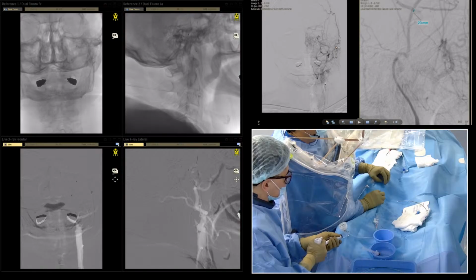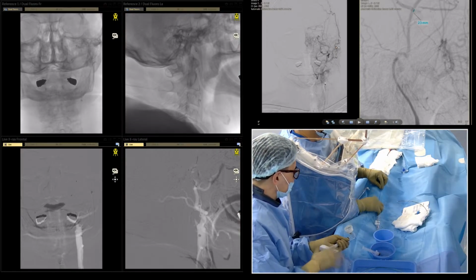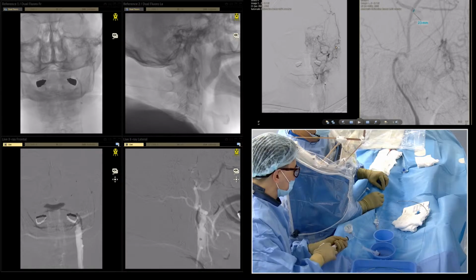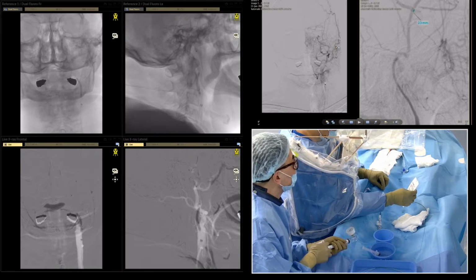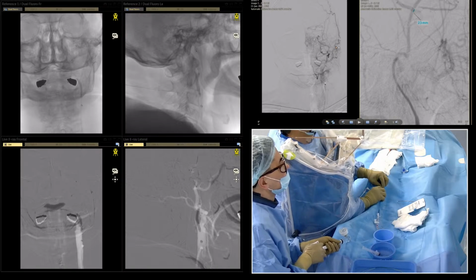So, earlier. I pulled my guiding a little bit. Earlier. I am asking to give 14 atmospheres, and nominal is 12, but we will give 14 and we'll wait a little bit. Okay?